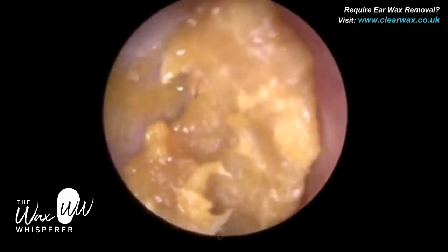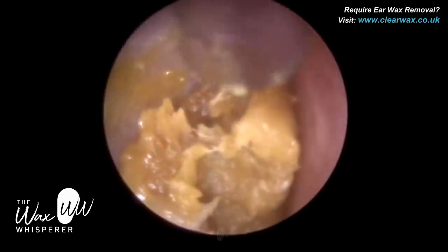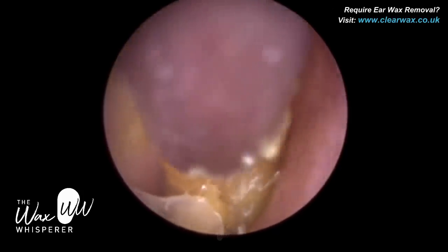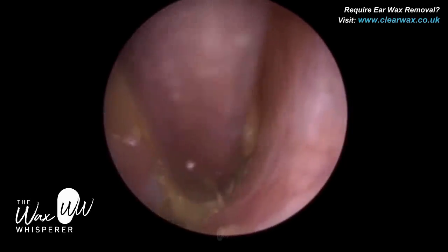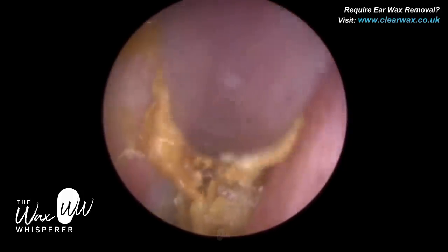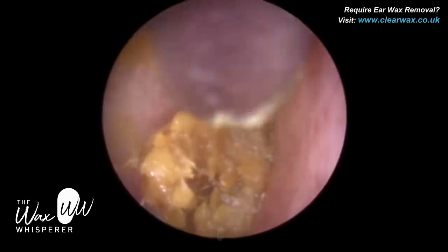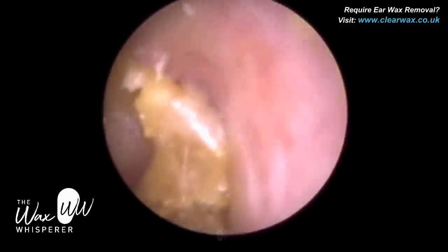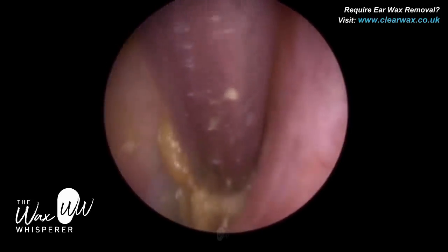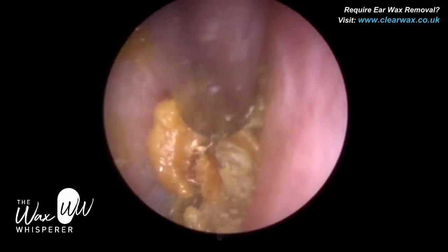We're probably about halfway there now. The average ear canal length is approximately 2.6 centimeters from the entrance extending to the eardrum, so we're probably about one and a half centimeters into the ear canal and now on the bony portion. The outer third of the ear canal is cartilaginous — semi-flexible and semi-sensitive, so we can apply a bit of pressure. On the outer third of the ear canal, that's where you have your hair follicles. Attached to the root of the hair follicles are the ceruminous glands, which secrete an oily sweat, and also the sebaceous glands, which secrete an oily lipid substance called sebum.